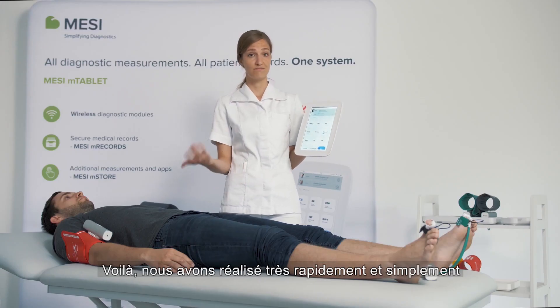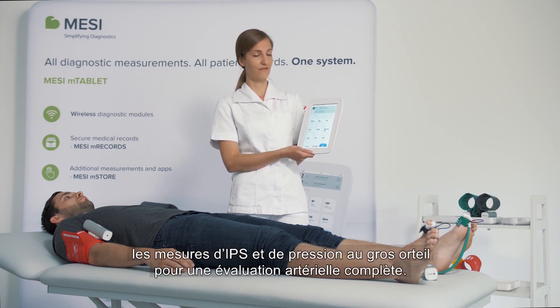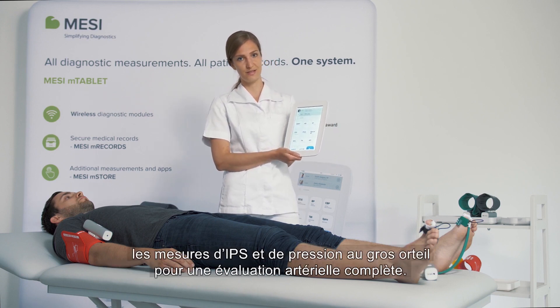So there we have it. Very quickly, very simply, very reliably — we have ABI and TBI for a complete arterial assessment.